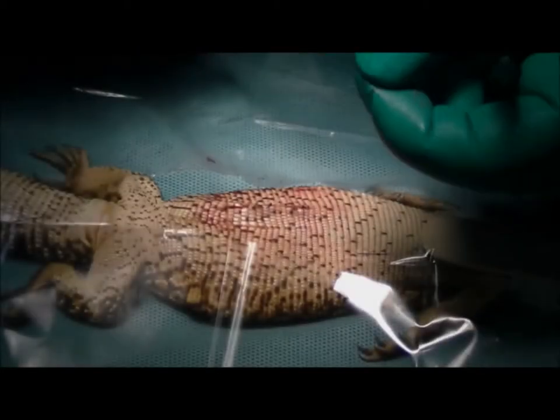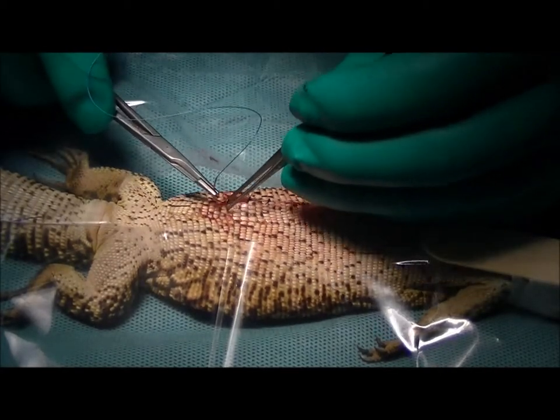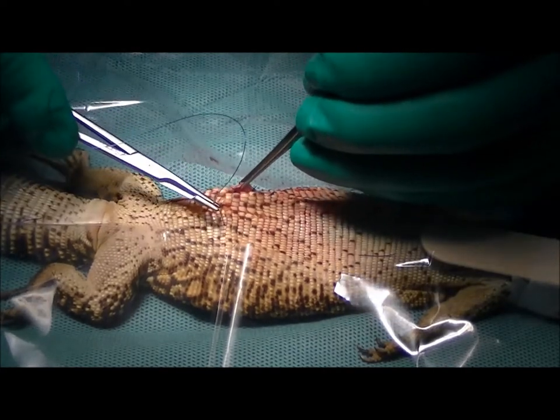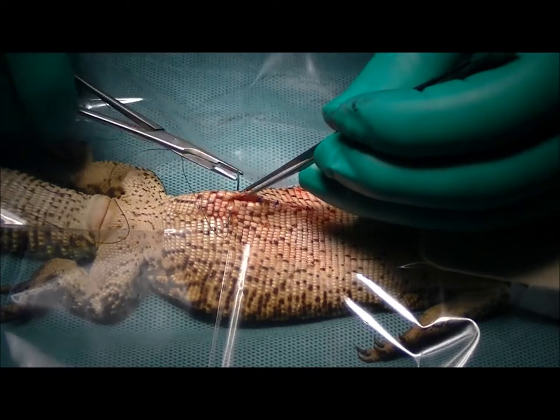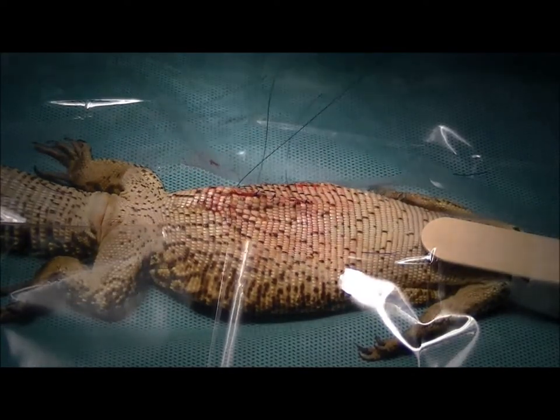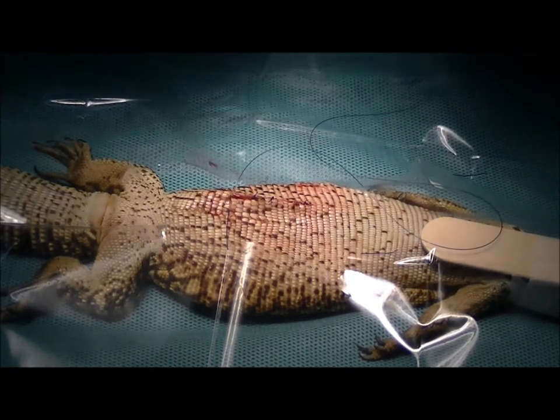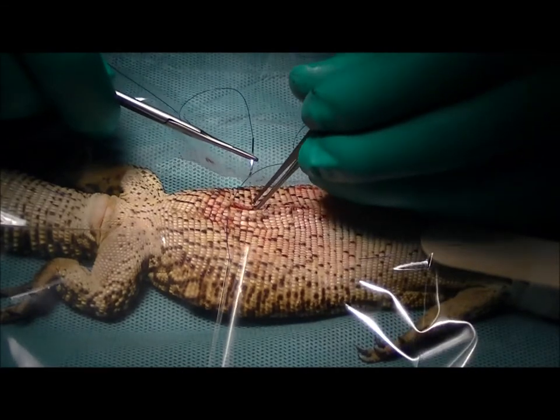Now we're going to suture that skin shut over the top. For the skin stitches we're using a suture material made out of nylon — a non-dissolvable suture. We'll take these stitches out in about six weeks' time. The owners may do that themselves — they've come from a fair distance today, so they probably don't want to drive all the way back just to have a couple of stitches taken out, so they'll likely be able to do those themselves.